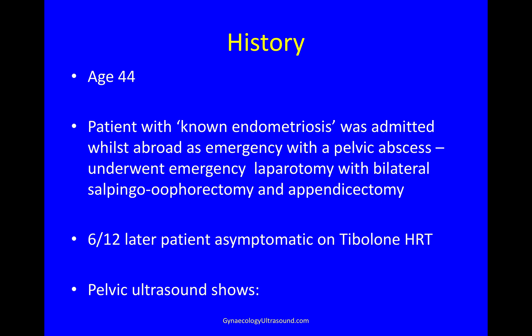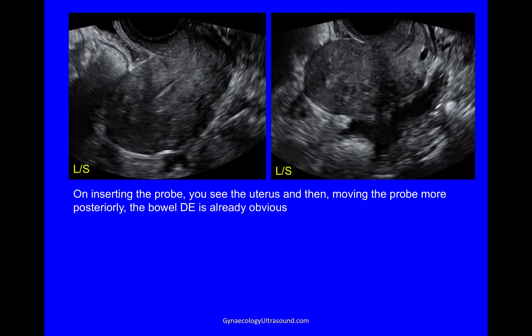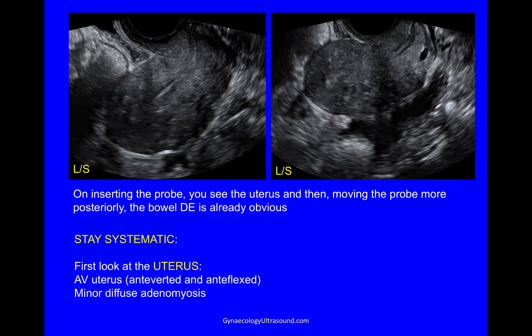When I scanned her I could see the following, and the point of this video is we'll do the scan as though we're doing it together. The first view is a longitudinal view of the uterus, and as you insert the probe you can see the uterus, but then moving the probe slightly more posteriorly you can immediately see this large plaque of bowel endometriosis. But even though it's already really obvious, try and stay systematic. First let's look at the uterus: it's anteverted and antiflexed, and there is some posterior thickening here and some features of minor diffuse adenomyosis.